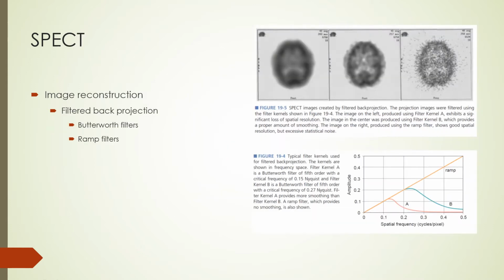After images are acquired, they are corrected for non-uniformities and center of rotation misalignments and errors before reconstruction using either filtered back projection or iterative reconstruction. In filtered back projection, the images are first filtered using a ramp filter together with a roll-off at different frequencies, as the graphs show. If only a ramp filter were to be used, the images will contain high amounts of statistical noise, which predominates in the high frequency portion. So the roll-off at high frequencies allows the image to be smoothed before reconstruction. So there is a compromise between spatial resolution and image noise.